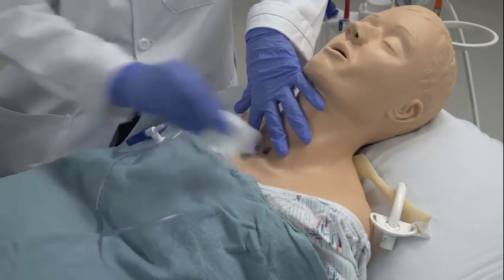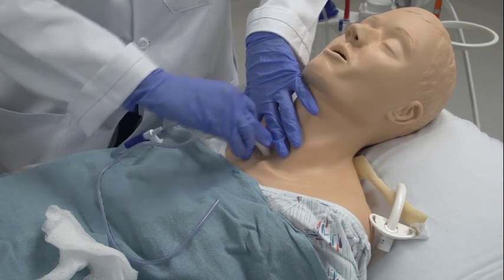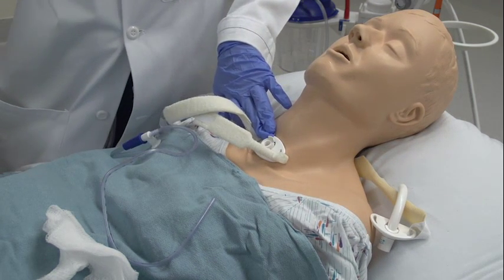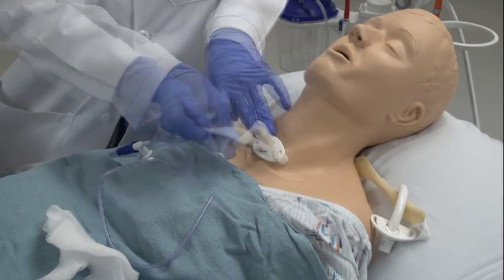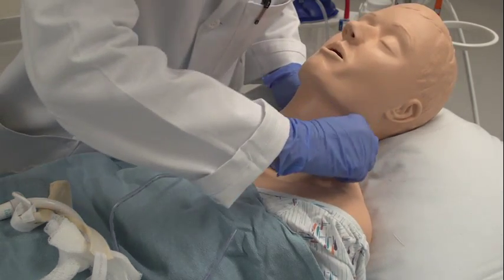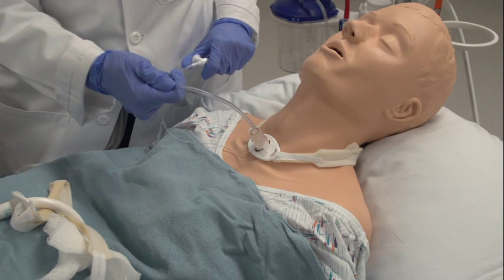Insert the obturator into the tube and apply lubrication. Apply firm pressure to the obturator or introducer as you insert the tube and slide the tracheotomy tube into the trachea. Stay sutures fastened to the trachea may be in place. If they are, hold them open to aid in reinsertion of the tracheotomy tube. Once the tracheotomy tube is in place, quickly remove the obturator and insert the inner cannula if the tracheotomy tube has one. Assess for proper placement by ensuring there is good airflow through the trach tube and by listening for bilateral breath sounds. Other methods to check for proper placement would be end-tidal CO2 or a colorimetric CO2 detector.